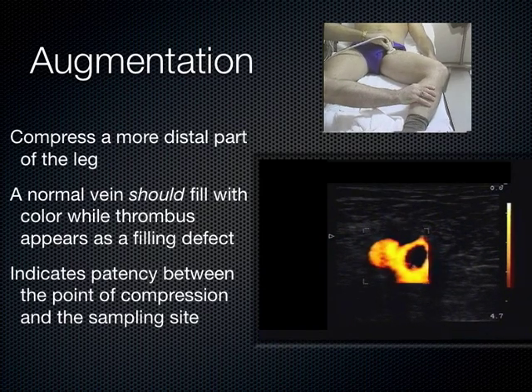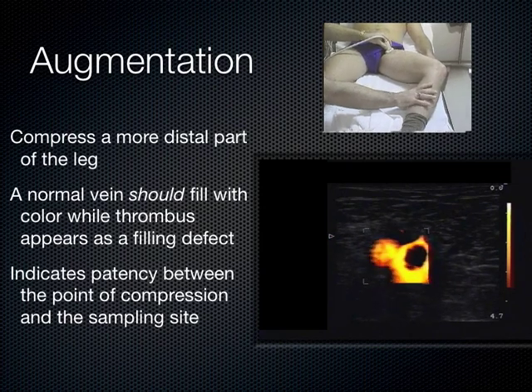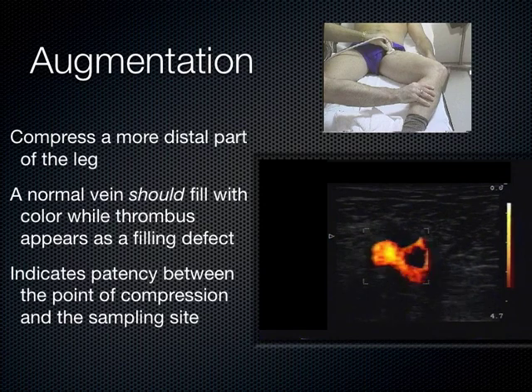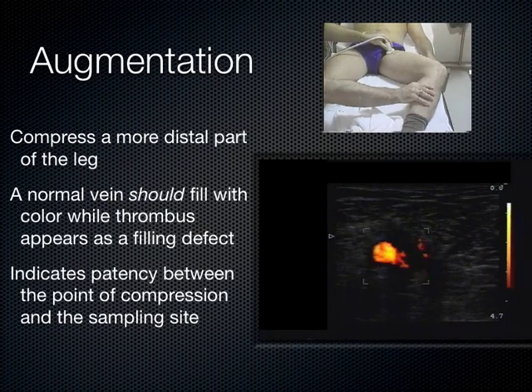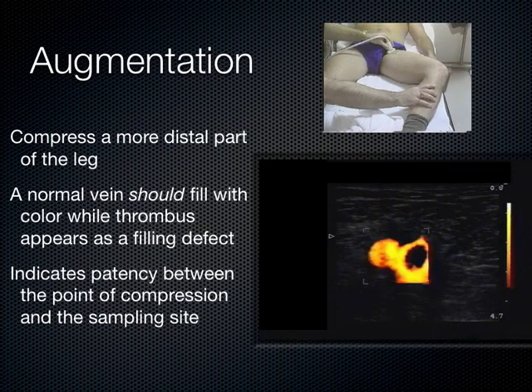It's really only the grayscale compression alone, the 2D ultrasound image, no color involved, that rules in or out the DVT. There's lots of other color techniques that don't stand up under clinical conditions, and so you can't really use that. Even though today we'll probably be doing it because it's fun to see the anatomy link up that way. I think that's cool to show you, but diagnostically it's not useful.